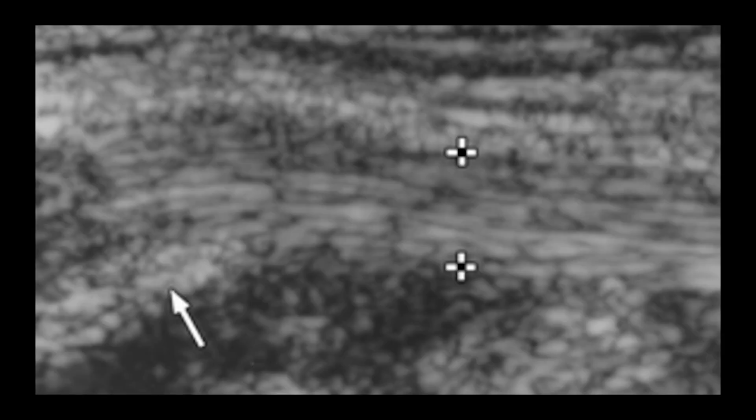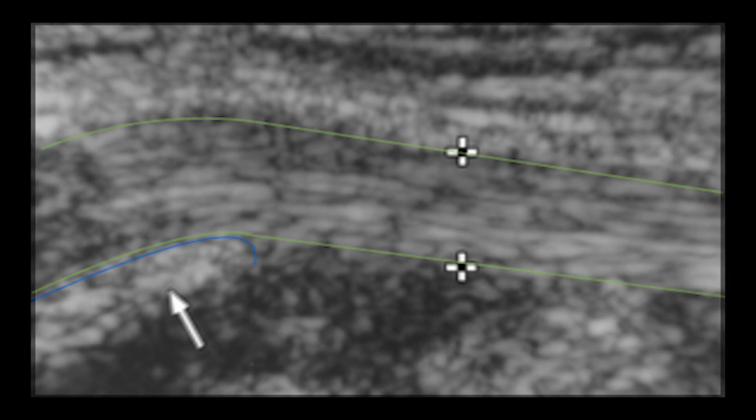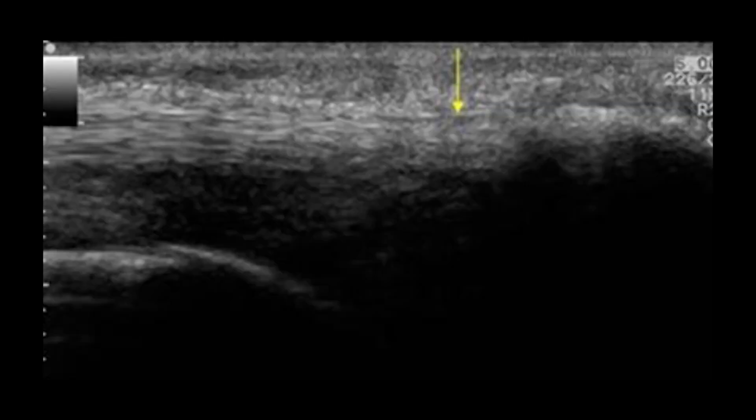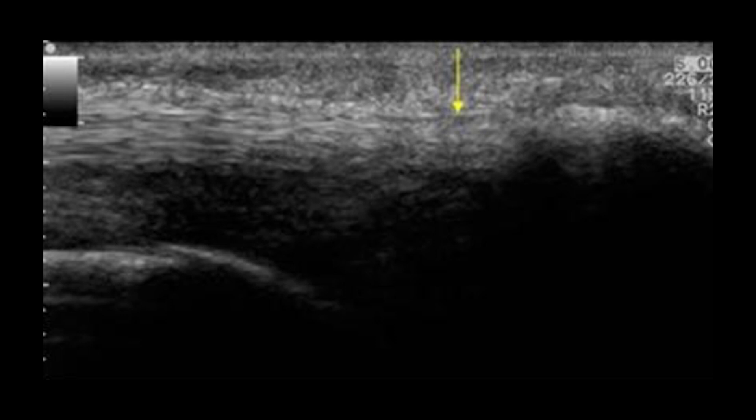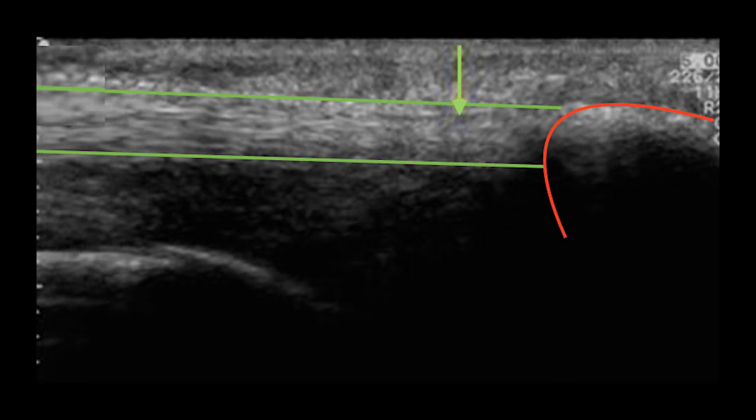Here you can see a long axis view of the posterior tibial tendon as it passes by the medial malleolus. The green indicates the posterior tibial tendon, and you can see that it has its characteristic normal fibrillar architecture. The arrow and the blue indicate the medial malleolus.